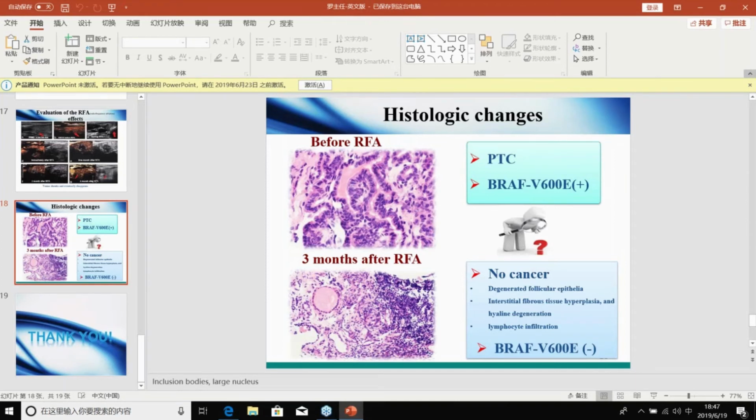So it's clear. Now you can assess, and of course this is a benign hypervascular lesion. So when you see some residual enhancing tissue, you immediately repeat ablation, or you complete the previous ablation, I think. So it is to guide your treatment.